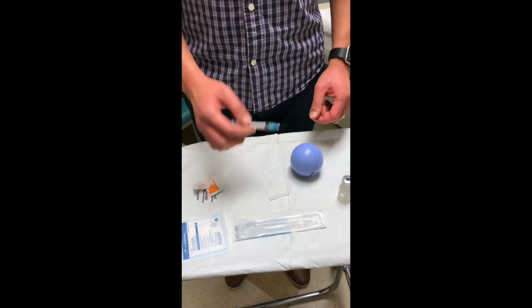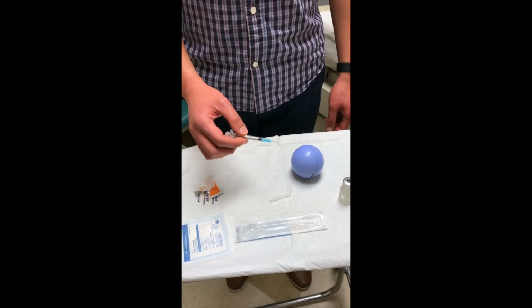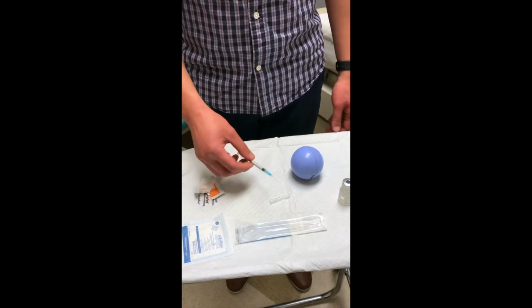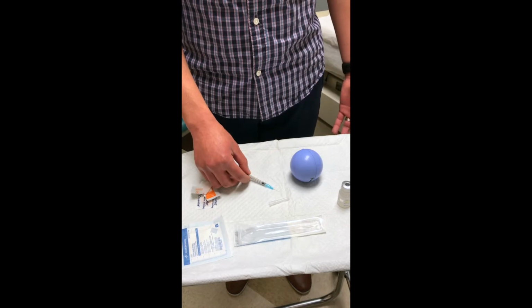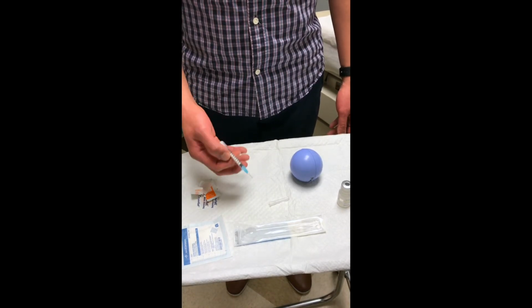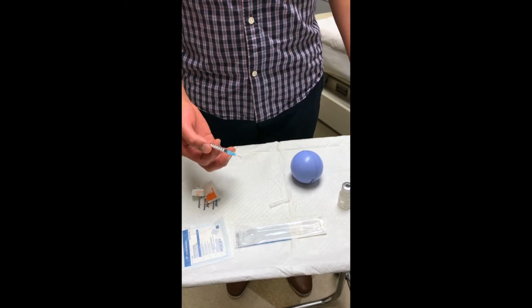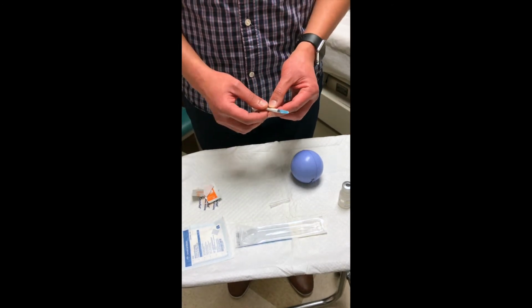So just a couple notes. Once you've uncapped your needle, make sure to not let it touch anything. If by any chance you dropped your needle, or it touches this end of the surface, or you drop it on the floor, it's a good idea to just toss the whole thing out, just to be safe and avoid the risk of infection. So now that you've successfully done a subcutaneous self-injection, just a couple more thoughts to finish up.